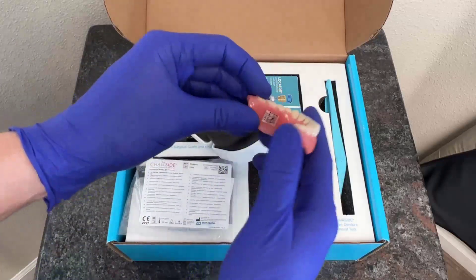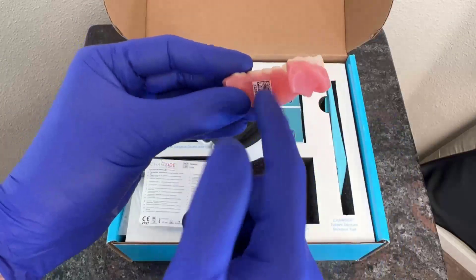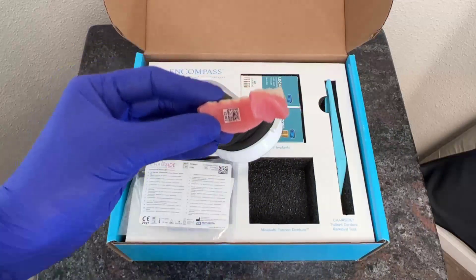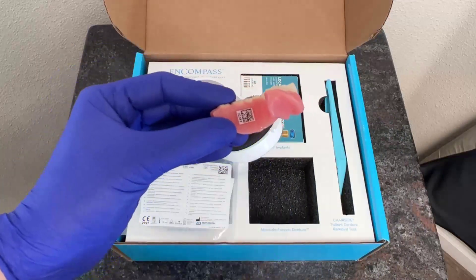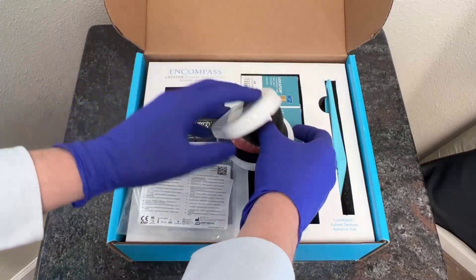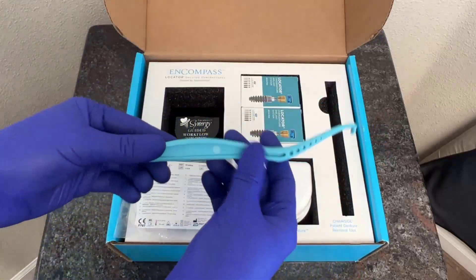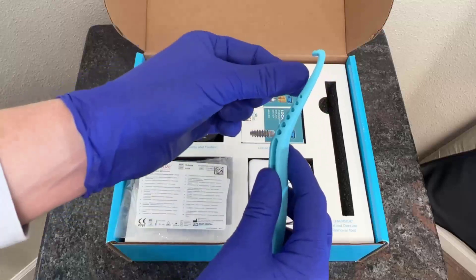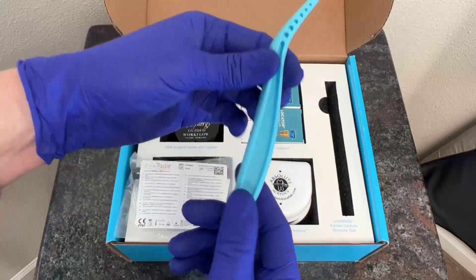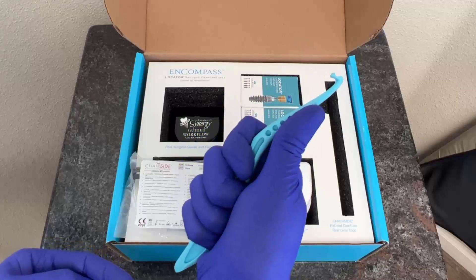Additionally, our Absolute Forever Denture includes our QR code, which is here on the side of the prosthesis. It makes for a very nice solution so that way if the patient, God forbid, ever loses their prosthesis or if they need something remade, they can go ahead and scan that with their phone or go to the website and then have a new prosthesis made. Additionally, it includes the Chairside Denture Removal Tool. The Chairside Denture Removal Tool comes up underneath the edge of the prosthesis to help the patient very easily service their prosthesis — and it's incredibly comfortable.